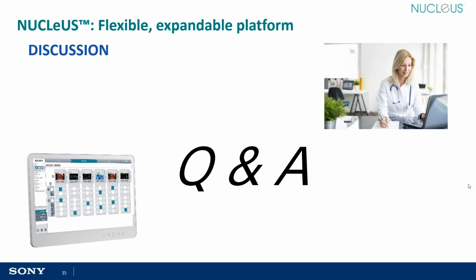Pretty good question, multiple layers. Talking about the worst case scenario, if there's an employee that knows that and wants to see it, they'll be able to see it regardless. The idea behind the NUCLEUS network is that it comes into our server. You have to be part of those specific VLANs. You have to have the connectivity. You have to have passwords. And then on top of that, you need to connect to the server, authenticate with our specific network, and then open your application and try to tap on it.